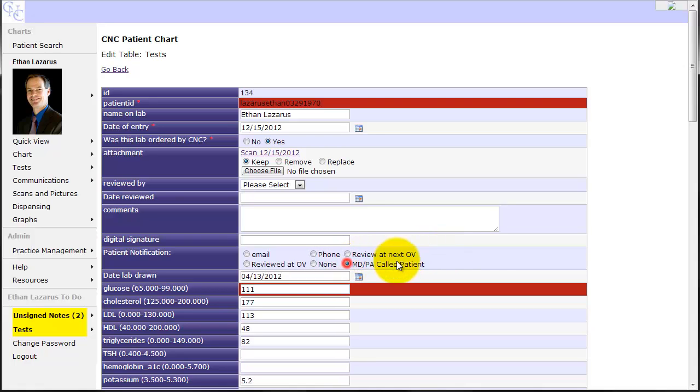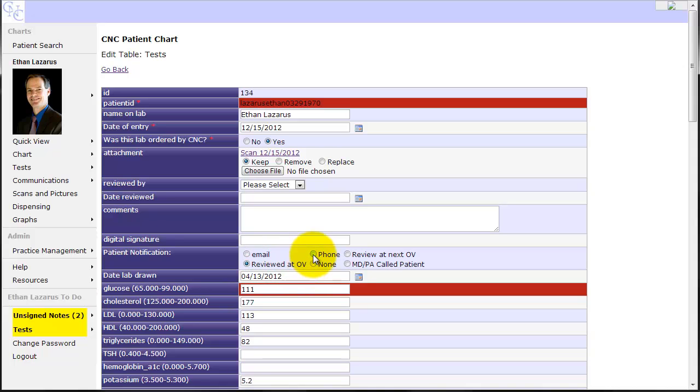I might just want to sign off on it and instruct the staff to review with the patient at the next office visit. I might call the patient with their results. I might want them just to get their results in their email box. I might be there with them and say that I reviewed with them at the office visit. Or I could select phone to ask the front office to go ahead and call the patient, which will generate a staff to do so that the front will be told to call the patient.